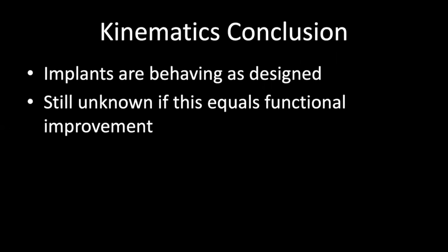So in conclusion, when we look at kinematics of medial pivot design, the implants are behaving as designed. It is still unknown if this equals functional improvement. So next, I would like to look at patient satisfaction.